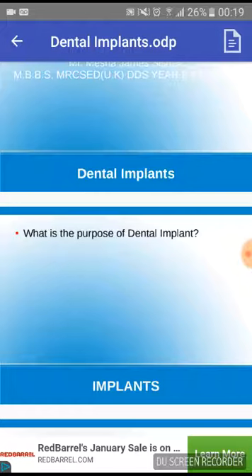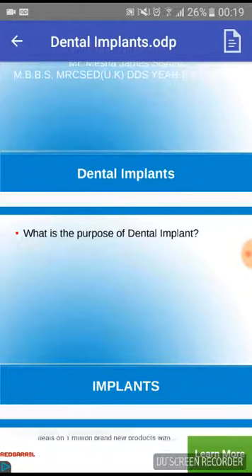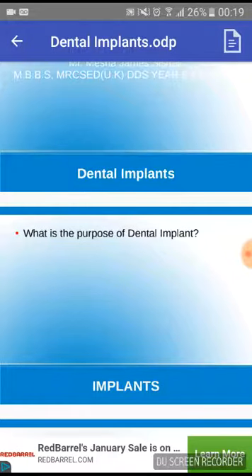Same concept here. So we're actually hoping that the implant doesn't affect the bone and cause any breakdown of the surrounding bone. So you're hoping that the bone can actually form around the implant, creating a very good base. So how are implants placed? They can be 2 steps or 1 step.